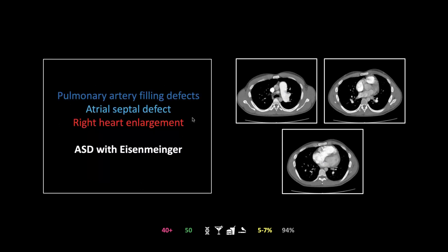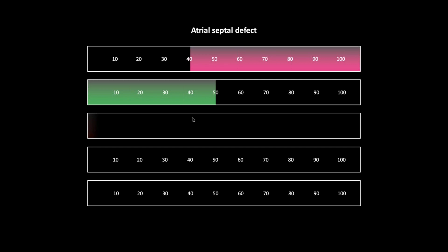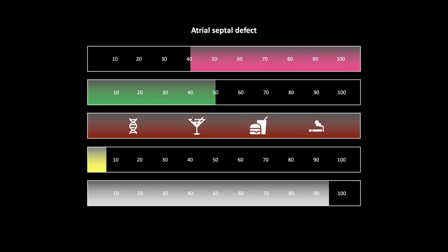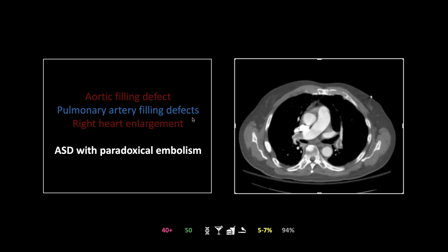That was an ASD with Eisenmenger syndrome. The next case is another ASD — women over 40, 50 per 100,000, weak maternal associations, seven percent mortality, and 94% CT sensitivity. This is the paradoxical embolism related to an ASD, precipitated by pulmonary embolism. Here you can see an aortic filling defect that descends down from the left subclavian — it's quite impressive and looks like a stick figure.